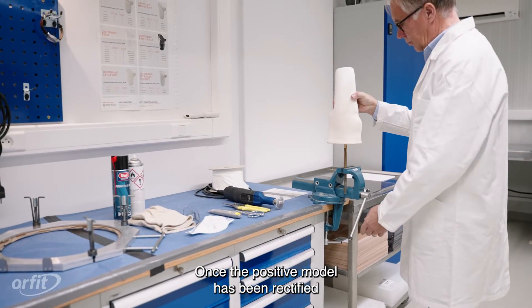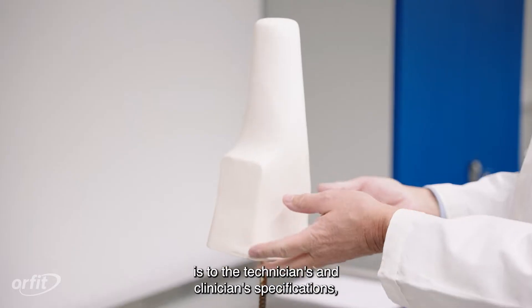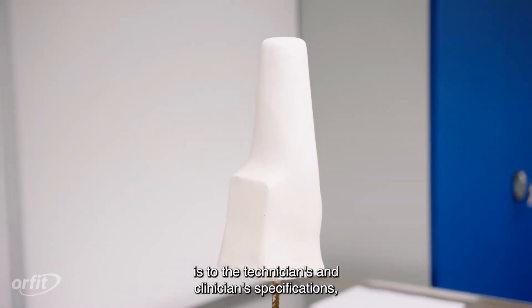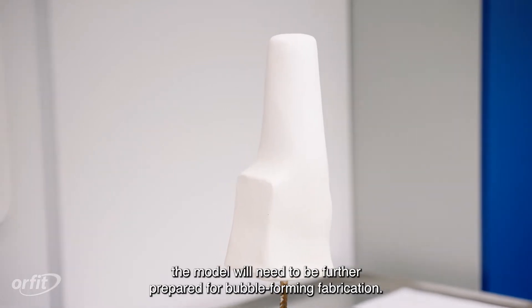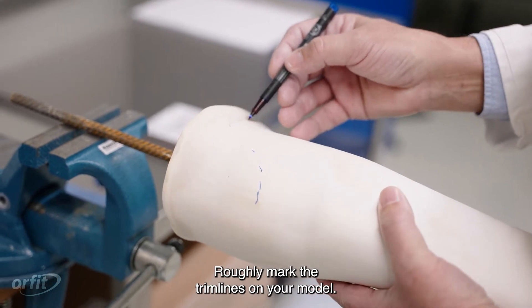Once the positive model has been rectified so that the shape, size, and smoothness of the model is to the technician's and clinician's specifications, the model will need to be further prepared for bubble-forming fabrication. Roughly mark the trim lines on your model.